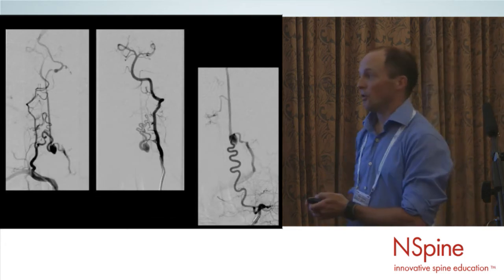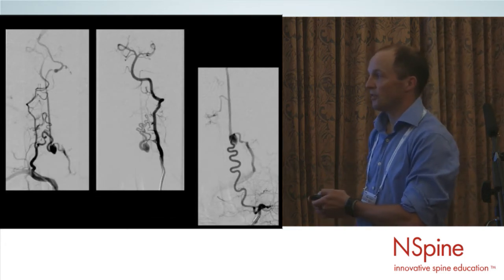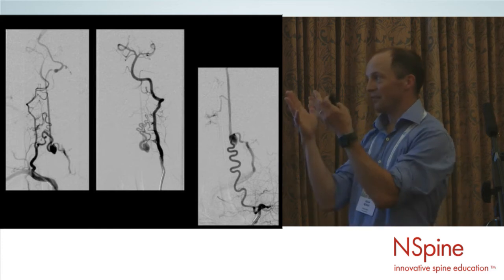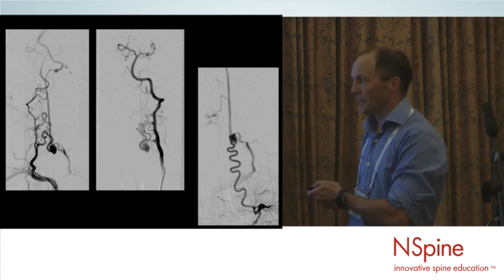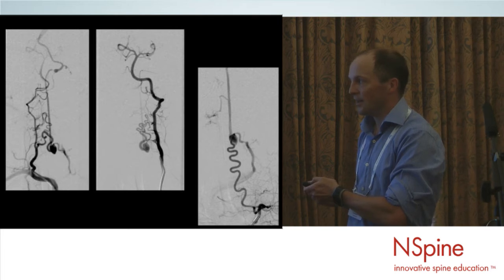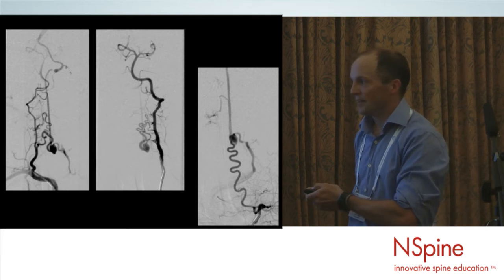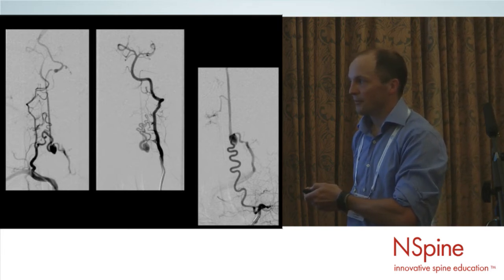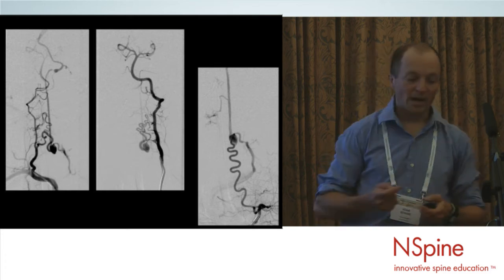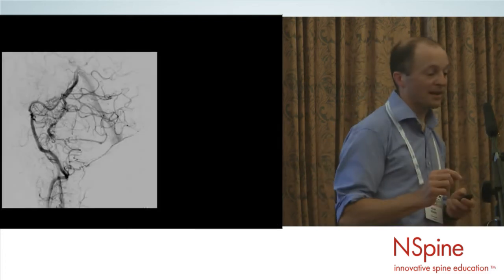Angiographically, he's got supply from both vertebral arteries. Again, it's identifying where the anterior spinal axis is. There's a plethora of vessels, and it points to the way they communicate. I point to the left-hand side here, the supply on the left, there's a flow void here, and that vessel is the same as this one. So I think from that point downwards, probably the anterior spinal axis. Again, it's identifying where the safe place to coil is.